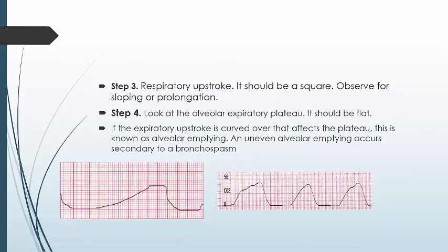This is not just your standard inflammatory response, this is actual bronchospasm. During inflammation, the small airways are narrowed, but they're narrowed evenly. But with bronchoconstriction, they are not even, so you get those differing slopes there. And this causes the capnogram to actually slope towards the plateau instead of forming a square waveform.